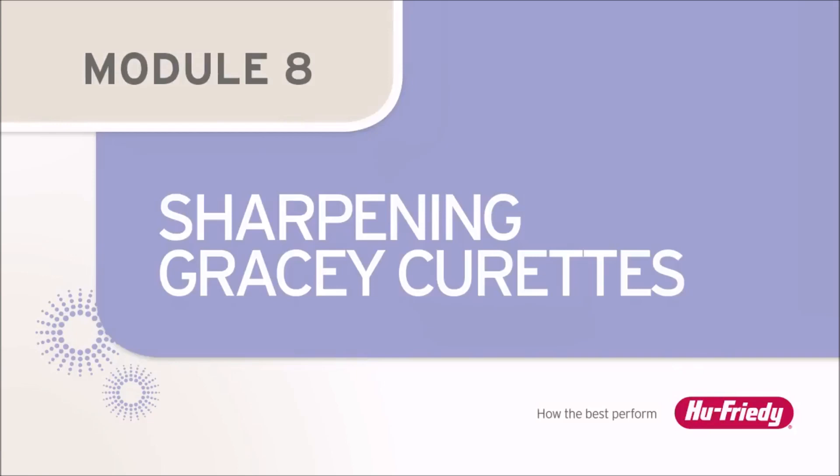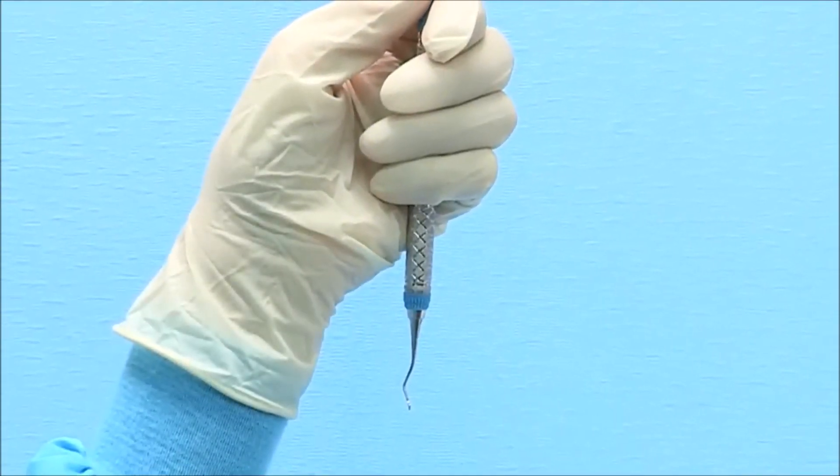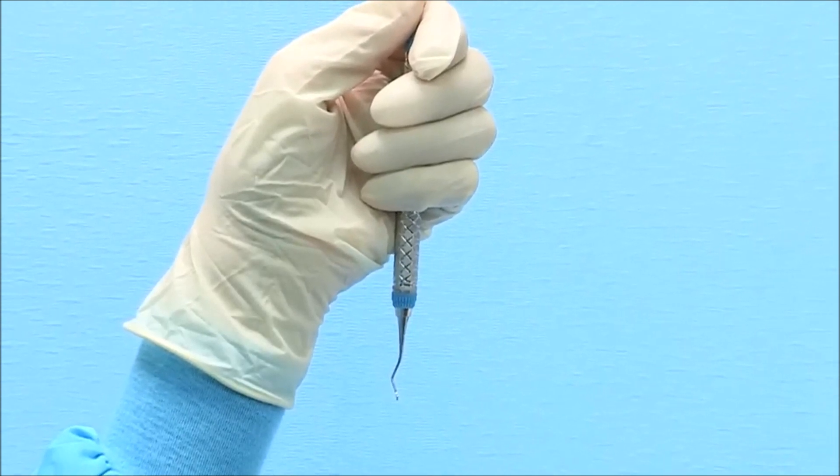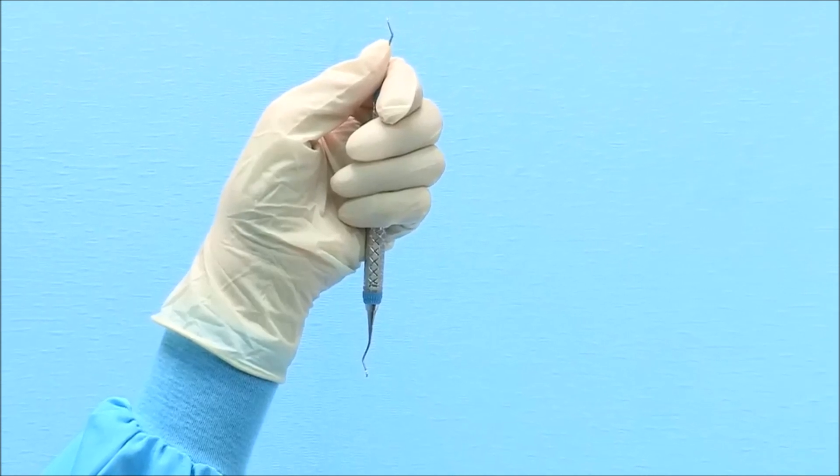Sharpening Gracie Curettes. The demonstration for sharpening a Gracie Curette will be shown with a right-handed clinician. Left-handed clinicians can proceed by using reverse directions.